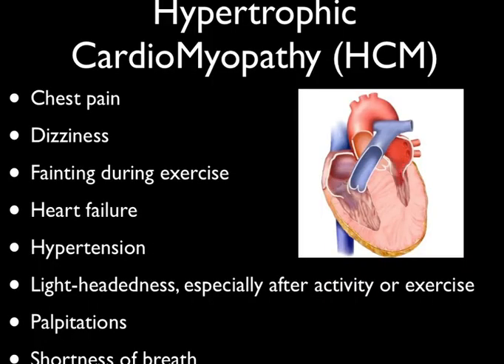So now that you know what the parasternal long axis looks like, you can get an idea of where the septum of the heart is. And you can see here with this patient who's got septal wall, or asymmetrical septal wall thickening right here. In other words, it's the septum that's thick and the other walls look okay. This is what's known as hypertrophic cardiomyopathy.